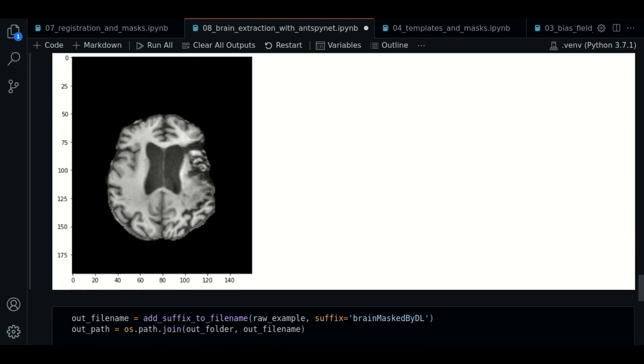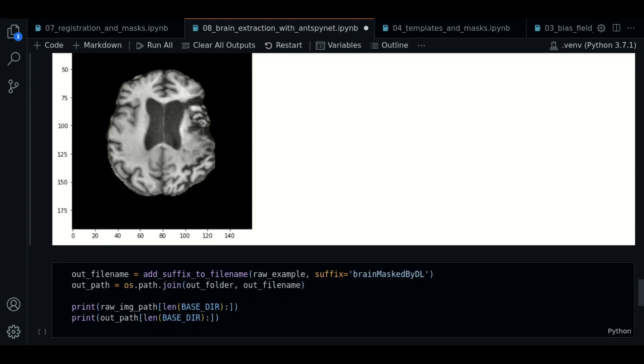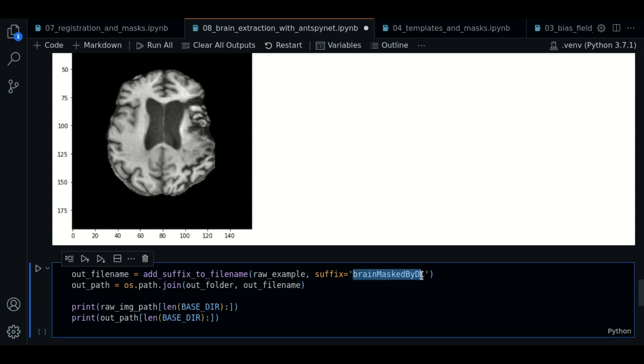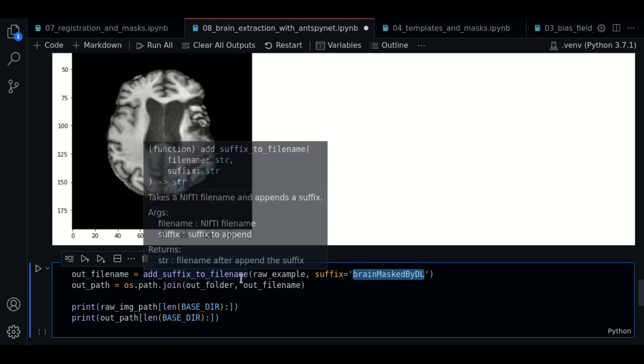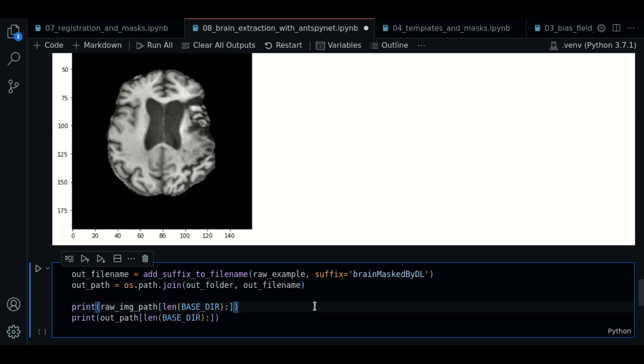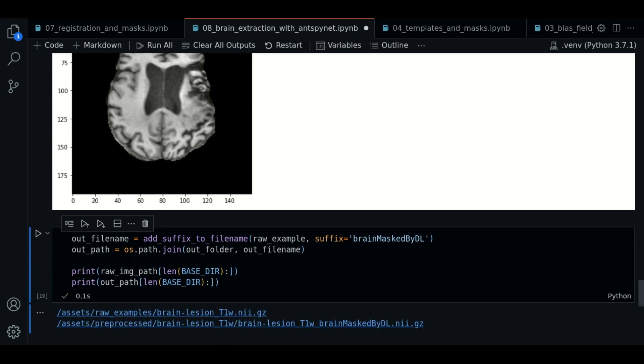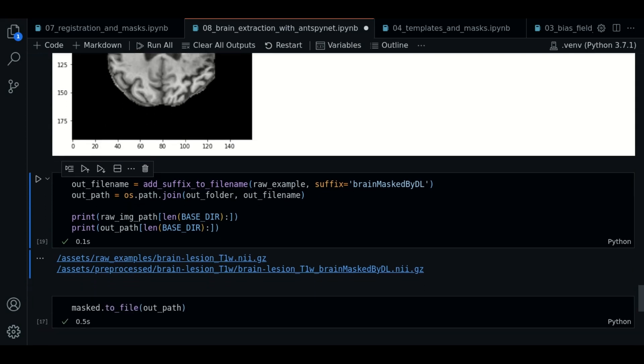Now we're going to proceed to save this result. We're going to call the to file method. We're going to use the suffix brain mask by DL because we're using a convolutional neural network. We're going to generate the path.